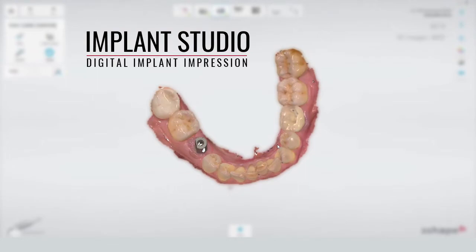In this video we're going to show you the workflow for making a digital implant impression. Before you start scanning, you're going to need to know the implant system and the diameter of the implant, and also whether you're fabricating a final restoration or making a provisional crown.